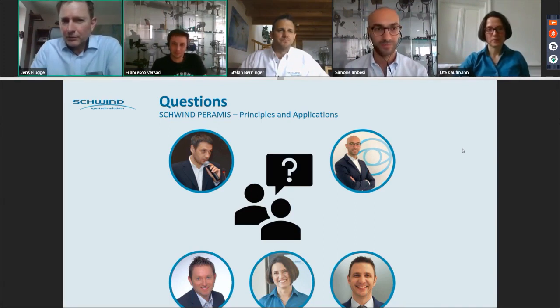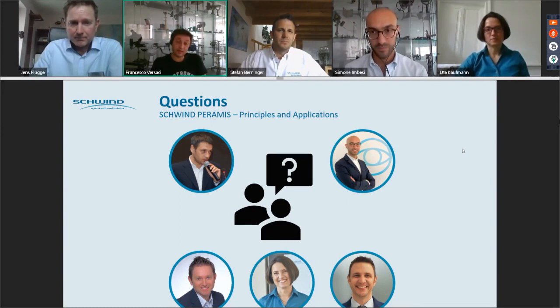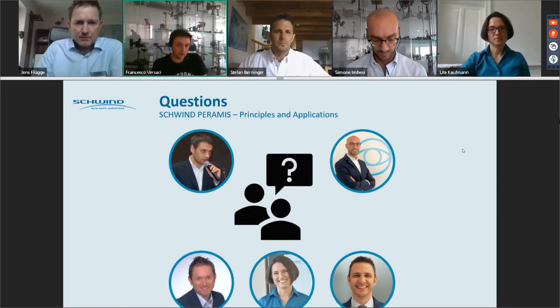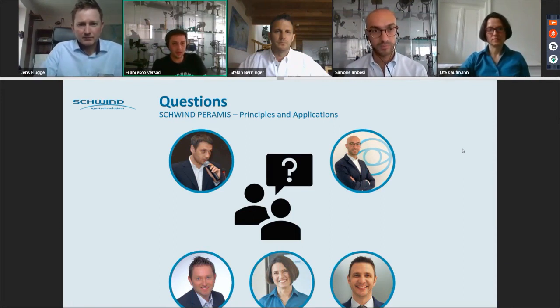So if you have dry eyes, would you recommend using artificial tears, Francesco? If you cannot systematically get a good acquisition, yes. I would suggest artificial tears that do not alter the viscosity of the eye too much, because then I could have a bad effect on the wavefront as well. But if the viscosity is fine, this is something that might be good.